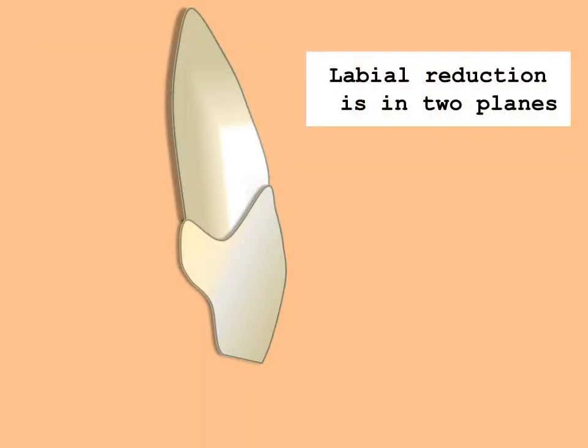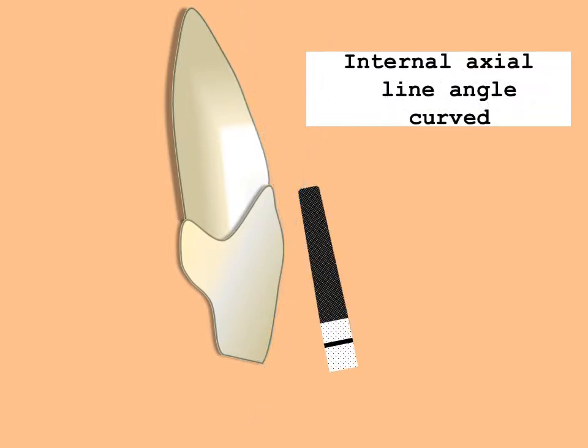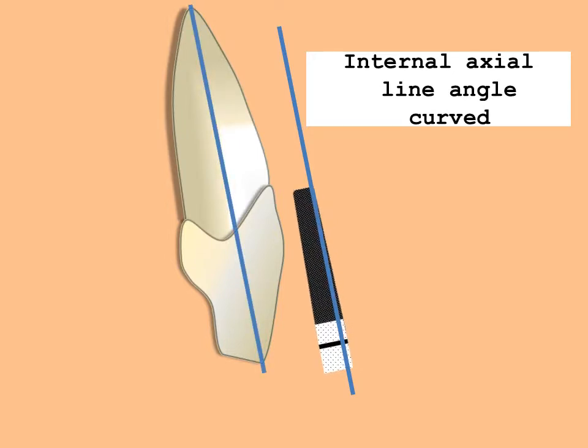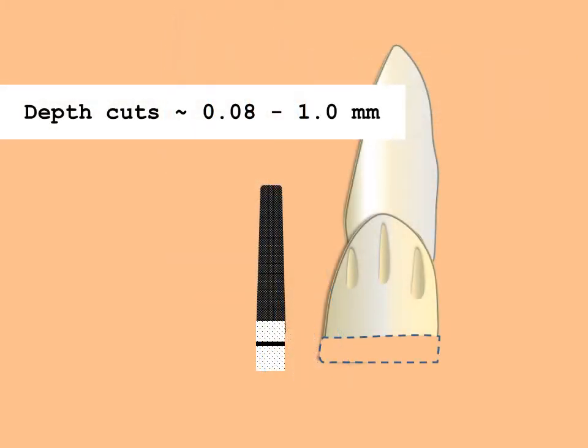One thing that must be stressed in reduction of the labial surface is the two-plane nature of the reduction. The first plane is parallel to the long axis of the tooth — this reduction is critical for resistance and retention of the restoration. The second plane is in the incisal one-third, parallel to the external surface of the tooth. The reduction is anatomic; the tooth maintains its basic shape after reduction. The surface is reduced to one millimeter to a uniform smooth surface. Depth grooves are placed in the cervical two-thirds of the tooth, with the burr held parallel to the long axis. Three grooves are placed of 0.8 to 1 millimeter in depth. The cervical two-thirds of the labial is reduced with the flat end of the diamond, producing a one millimeter curved shoulder finish line. The burr remains in contact with the wall of the preparation, thus forming the necessary taper.